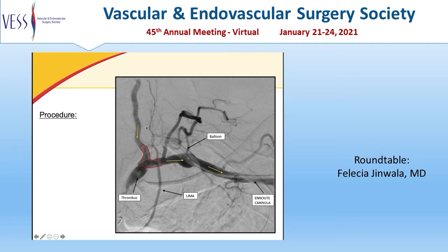Of note, the Silk Road device was used to maintain flow reversal, which was confirmed both visually and fluoroscopically, and is demonstrated by the yellow-orange arrows. Also noted in this image is patency of the patient's prior CABG. Labeled here is thrombus once again in the native subclavian artery. This has now been excluded by the deployment of the 2 stents, allowing for exclusion of the left vertebral artery.